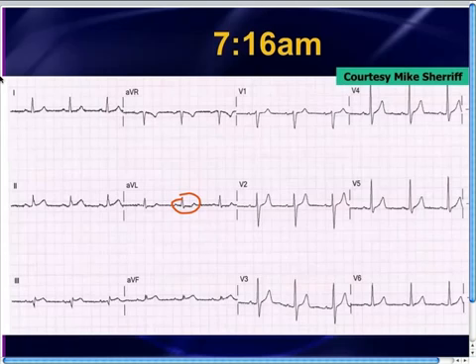And by the way, how did he know about that? Well, we've talked about this before on this EKG Weekly podcast or videocast. If you go back through the files, look at October 30th, 2011. The EKG case of the week from October 30th, 2011 was a full discussion all about lead AVL and how mild abnormalities in lead AVL can predict impending inferior wall STEMIs.